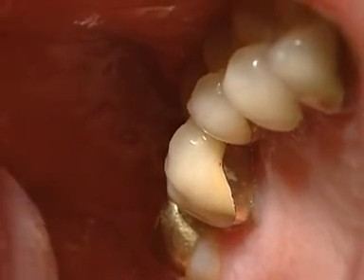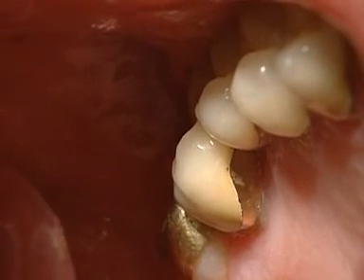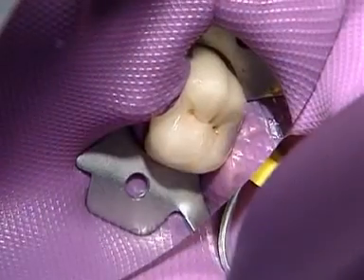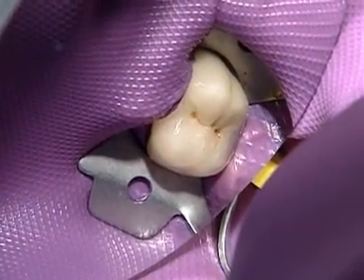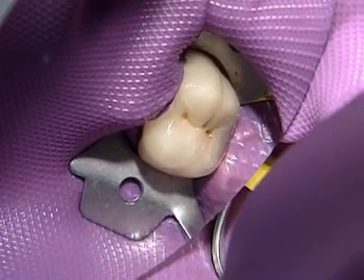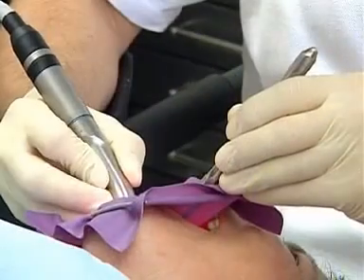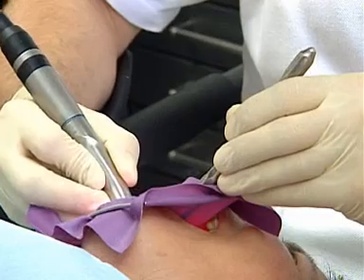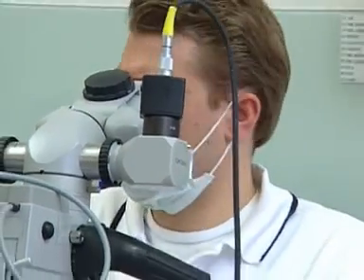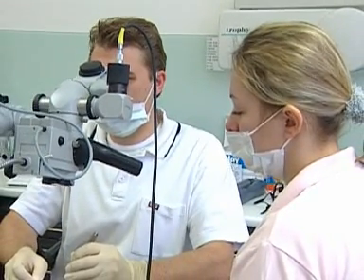The tooth serves as the abutment for a bridge. It is therefore particularly important to preserve it. The rubber dam provides safe protection against aspiration of an instrument. It stops saliva from contaminating the treatment site, thus enabling the dentist to concentrate fully on the treatment. A stereo microscope is used, making the situation easier to evaluate and increasing efficiency of the treatment.